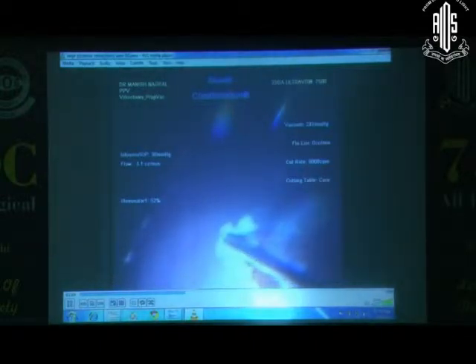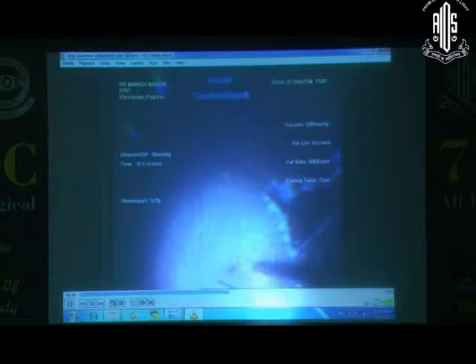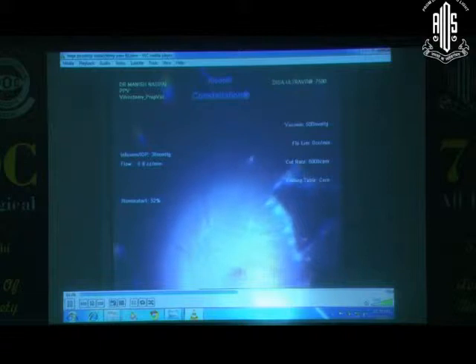good diathermy mark so that I don't encounter a lot of bleeding, and make a linear cut to relax that area. I had presumed that by doing so I would be able to do adequate relaxation to make sure the macula gets flat in the process. As you see, I'm increasing the retinectomy size and then putting in perfluorocarbon to assess how the traction resolves. Slowly you see some traction has decreased, but there are still folds which go around the macula, which would obviously compromise visual function.